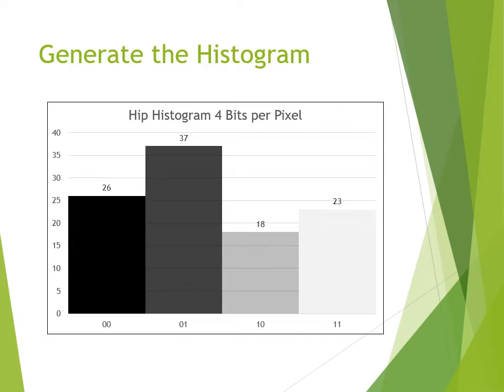At this point you're scratching your head and saying, well, this is just a bar graph. And you would be right. The histogram is a bar graph containing a minimum of 4,096 very thin bars, all displayed in a couple inches of space, so the result doesn't look like a bar graph. Also, in some histograms, the bars are all displayed as one color, so they are not distinct one from another. So the process to produce a histogram is to sort the density value of the pixels, count the number of pixels with the same density value, and display the result as a bar graph.